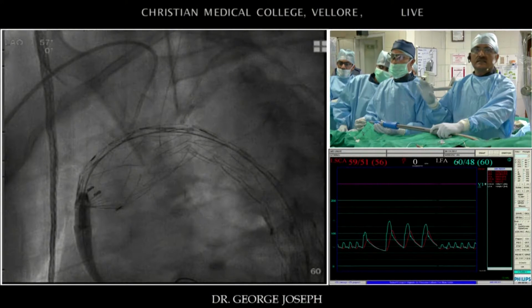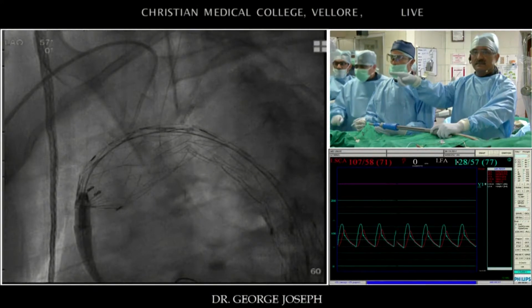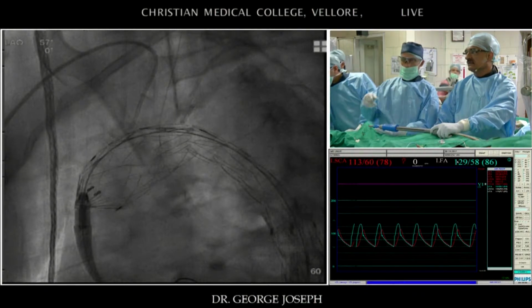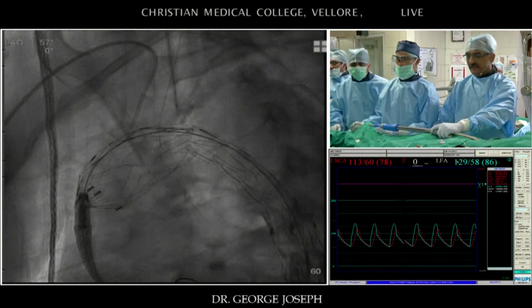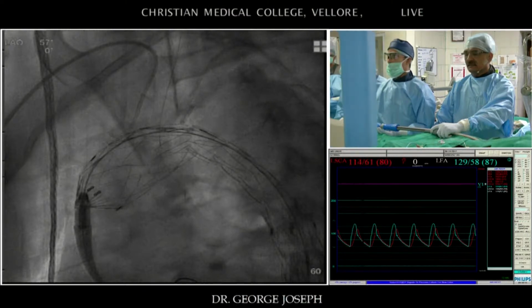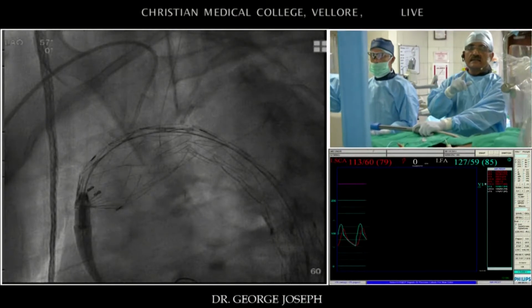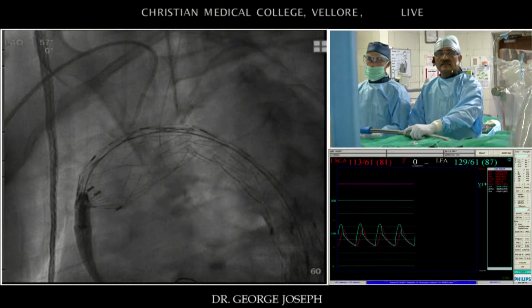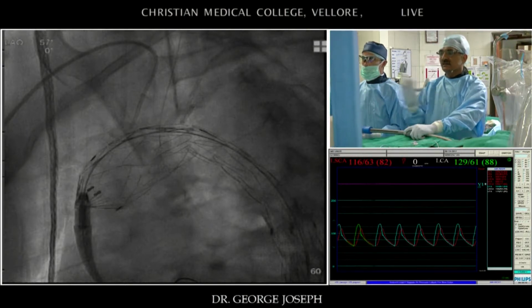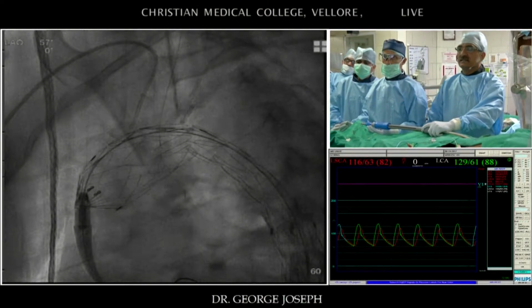All right, now let's look at the three pressures. On the screen here, can we show this pressure to the audience? Yeah, I think you can see it. There is a blue, which is the left carotid, and the red is left subclavian. And the anesthetist has the innominate, which is reading 138. So I know that all three fenestrations are flowing, and there is adequate cerebral perfusion.